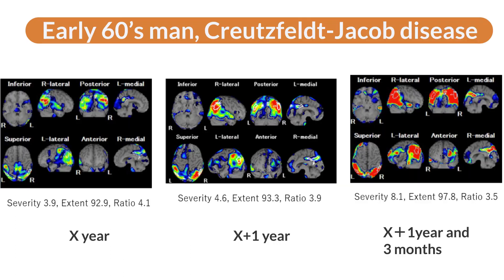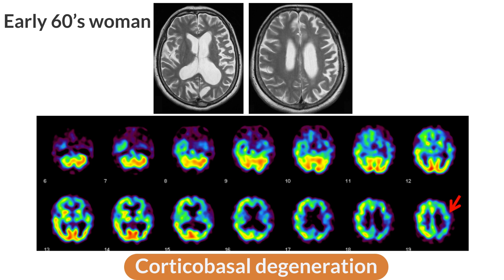In a case of Creutzfeldt-Jakob disease, the patient was initially followed as Alzheimer's disease, but after one year the dementia progressed rapidly. Brain perfusion SPECT showed decreased perfusion in the temporoparietal lobe and posterior cingulate gyrus to precuneus, and after one year and three months the perfusion decrease in the same area became extremely severe — a pattern similar to Alzheimer's disease. In a case of corticobasal degeneration, MRI shows marked atrophy of the left cerebral hemisphere, and brain perfusion SPECT shows marked hypoperfusion in the left frontoparietal lobe and hypoperfusion in the left basal ganglia.